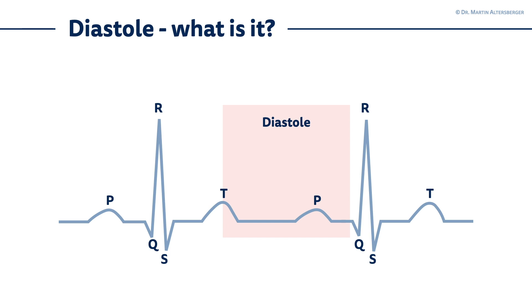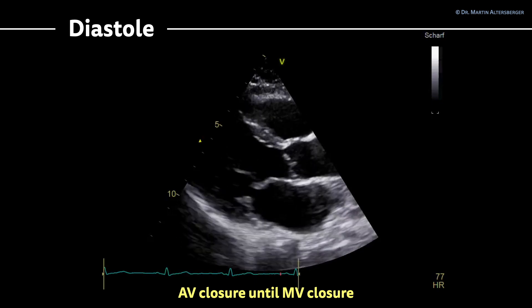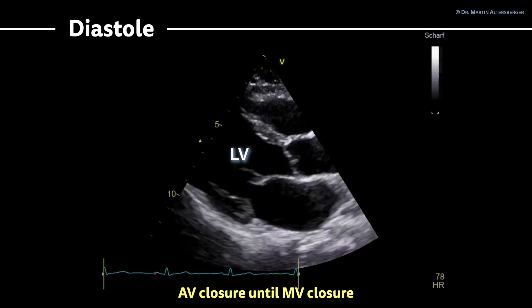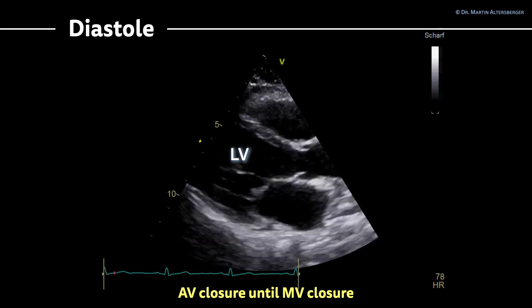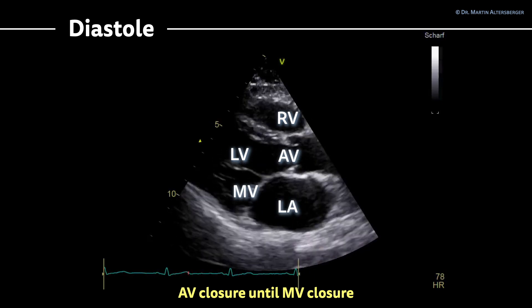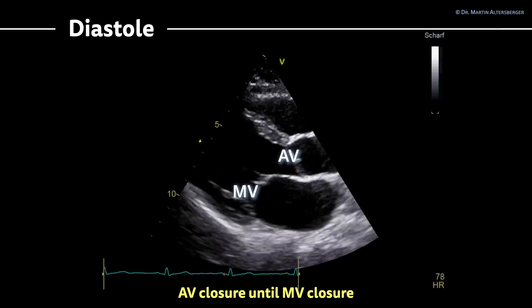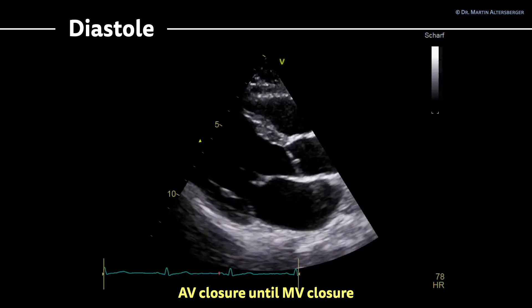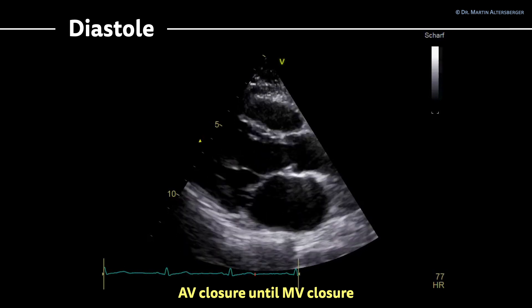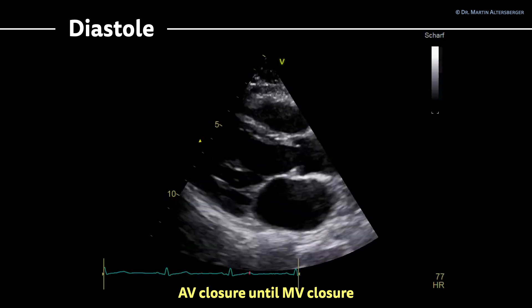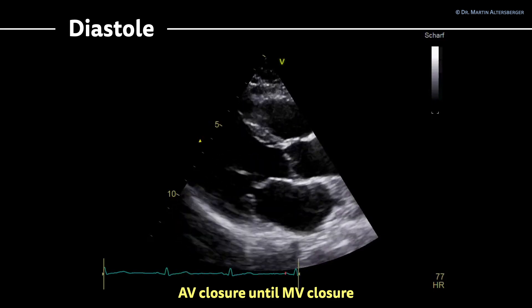How does diastole not only look in the ECG, but how does it look on the echocardiogram? In this case, you see a parasternal long axis view of the left ventricle, focused on the left ventricle. You can see on top of the image the right ventricle and the aortic valve, the mitral valve and the left atrium. Diastole is the time from aortic valve closure until mitral valve closure. So when systole is done and the aortic valve closes, we wait for the opening of the mitral valve and then for the mitral valve to close again. This is the filling of the ventricle — diastole.